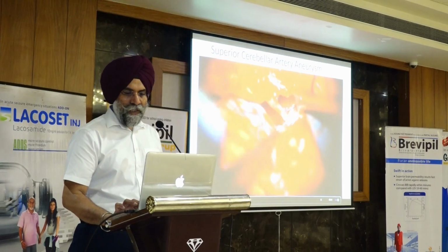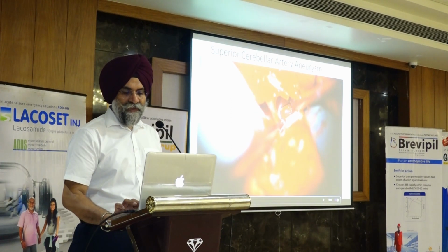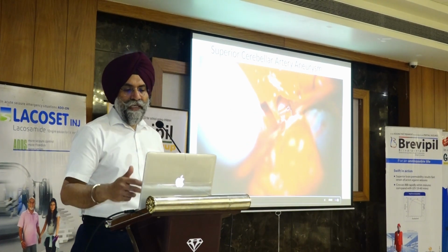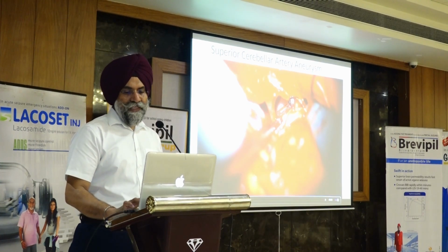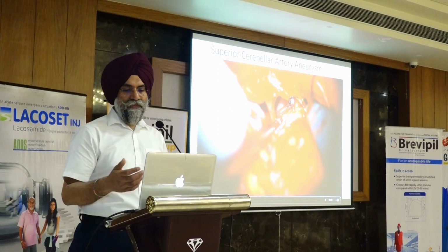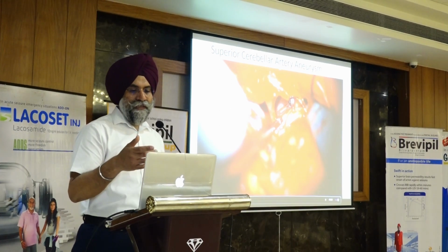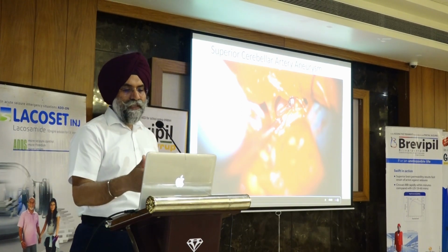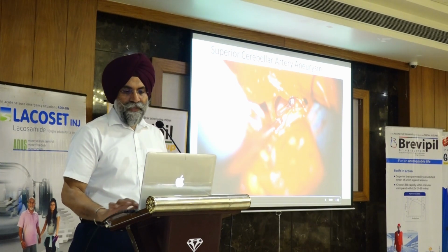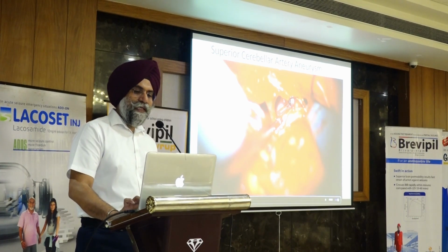A temporary clip has now already been placed. It is just behind that, and this corridor gives the best approach for this aneurysm. So this is a temporary clip to the basilar artery. Otherwise, for this aneurysm we may have to take a half and half approach, maybe subtemporal. Sometimes these are very difficult to approach from Kawase's triangle. So this becomes direct.